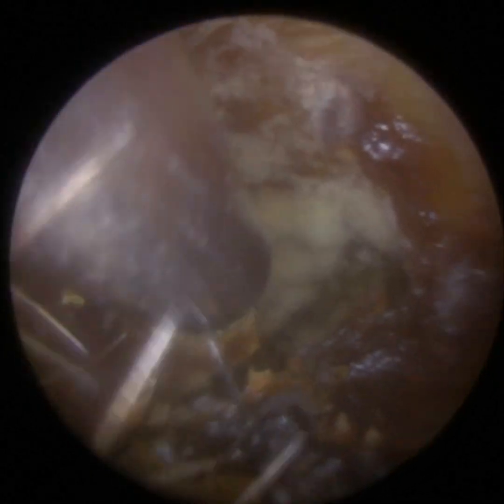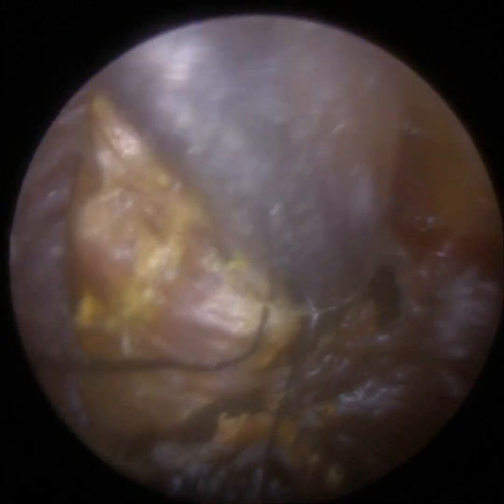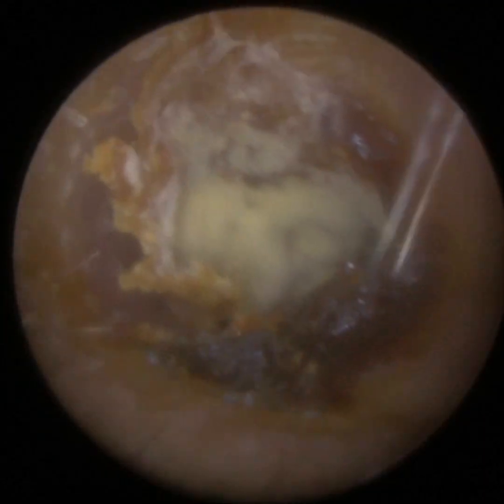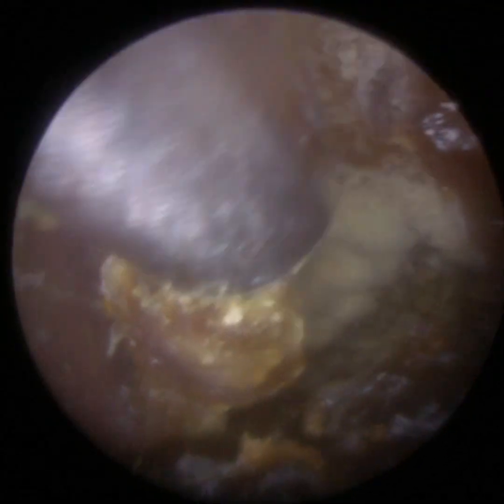Now this skin is really, really adhered, and I am going to put some drops in a moment. What I want to do, I want to try and keep this skin, I don't want to over soften it because I'm going to use some forceps in a moment. And we want this skin to be a bit crusty and a bit firm.